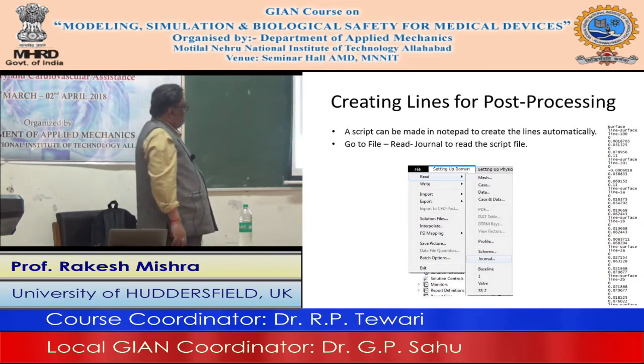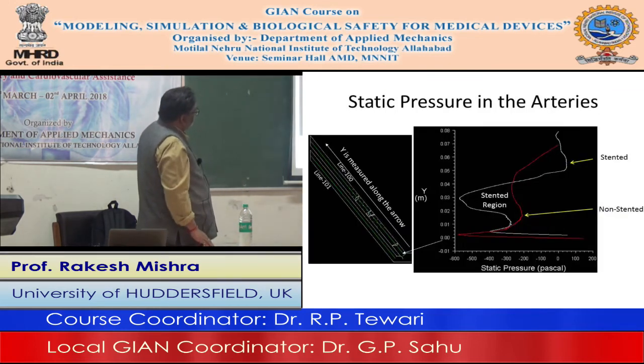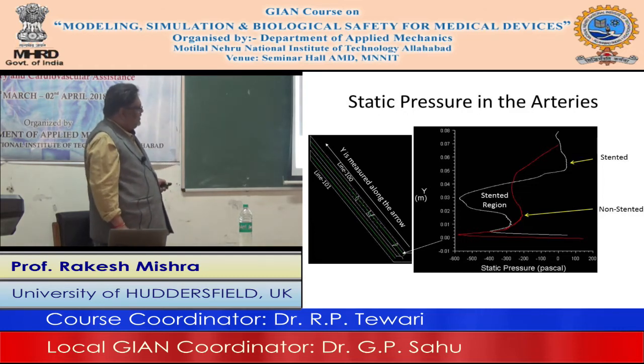Here. So now you see. This is line 100 and this is line 101. So this is the stented part. This is the unstented part, and we are trying to simulate the flow along it. So here I am showing static pressure on the unstented artery and the stented artery along the center line. Okay.